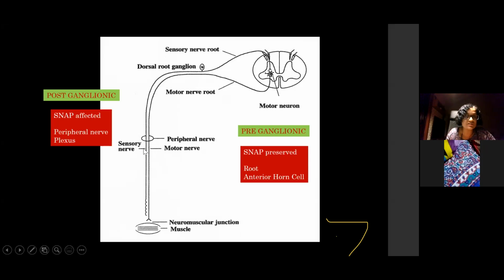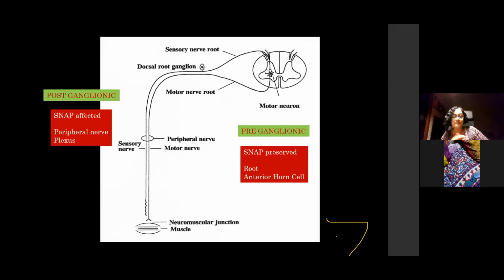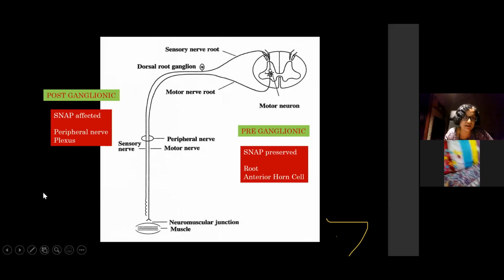So the sensory nerve action potential will be affected in postganglionic lesions as long as the nerve that you are testing has a sensory part, and also the sensory part can be easily tested using your nerve conduction study. So suppose you have a nerve like the axillary nerve that you know has a postganglionic part, it has sensory branches, but we can't reliably test it on nerve conduction studies. And hence, it's very difficult in such nerves to say whether, whenever you have a lesion in that area, it is postganglionic or preganglionic. But when you have median nerves, radial nerves, ulnar nerves, very easy to test. So there you can easily use this method to see whether the lesion is postganglionic or preganglionic.